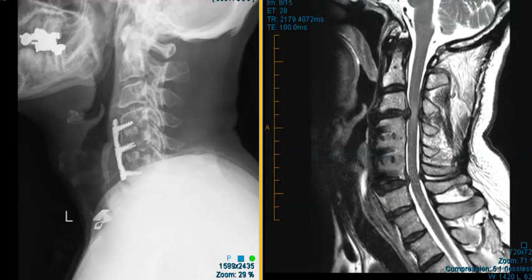Hello, this is Dr. Gay from FirstSync MRI. This is a 64-year-old male who had surgery about 12 years ago. He had neck pain, and they found some disc herniations, and they did a fusion.